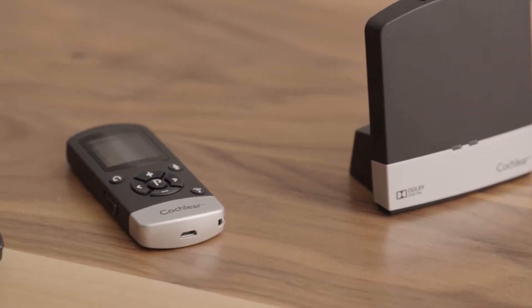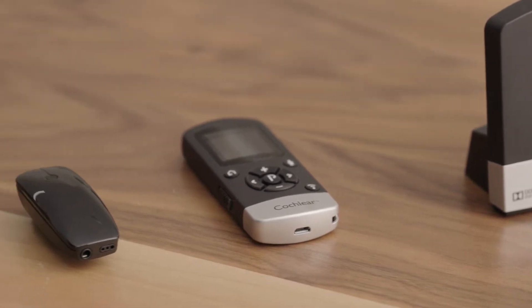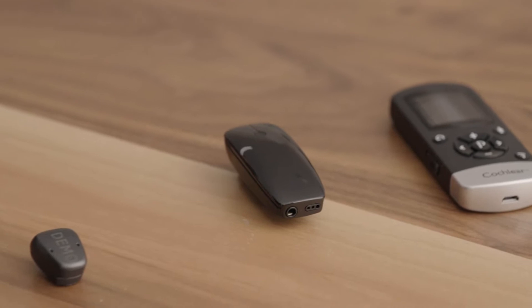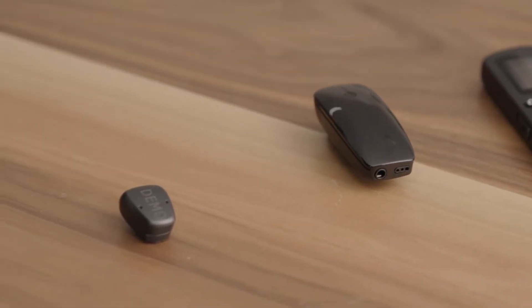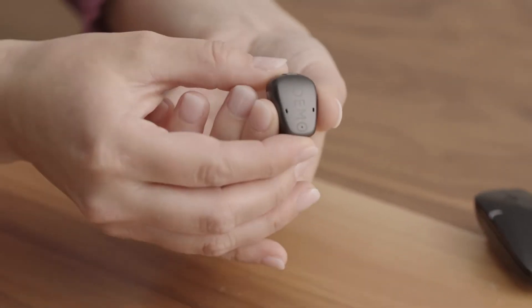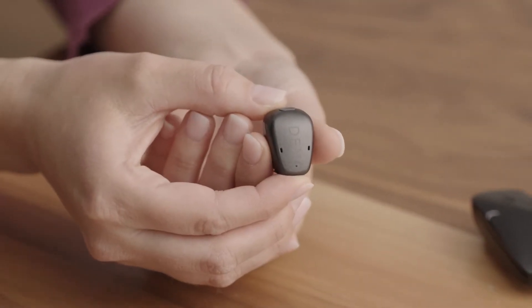It's important to note that everything we talk about today may not be in your kit. You'll have some combination of these accessories based on what you and your clinician determined is the best fit for you. Additional accessories can be purchased on the online Cochlear store. Let's start with the Cochlear Baja 6 Max sound processor.